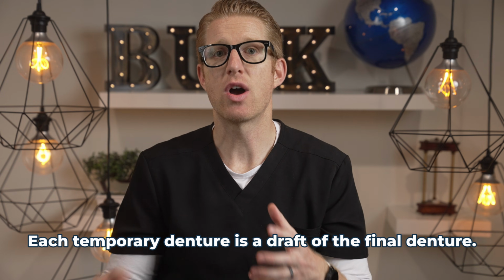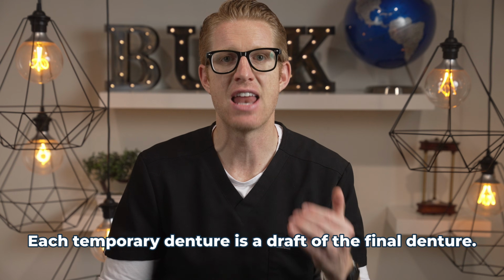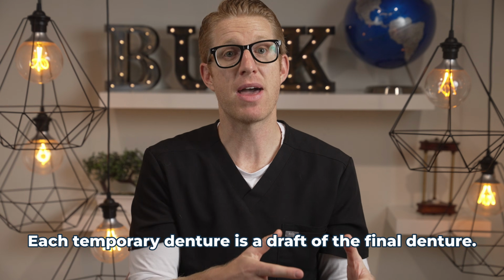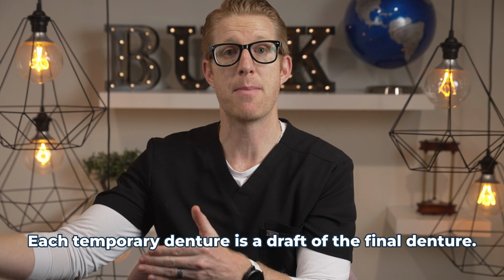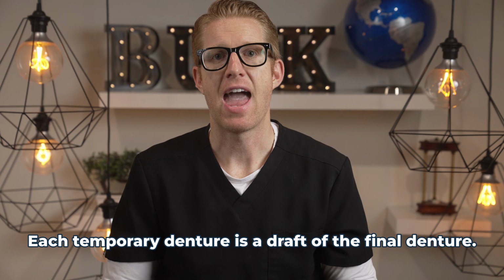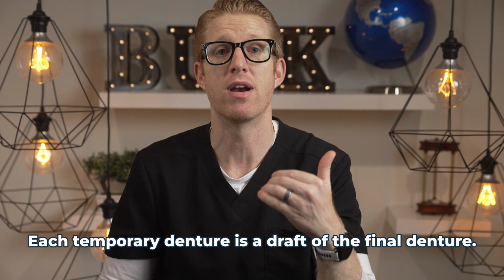So you really don't know what you're going to get in the end, and the process is not predictable, whereas in my method, along the way, you're designing the permanent design with the patient's input. I have done both ways, and this way is much more predictable, and the patients even love it more in the end. Now, after 6 months of that patient being in these dentures, everything has healed, and the oral surgeon gives the clearance for the final prosthesis to be made. That is, if all the implants have integrated well.